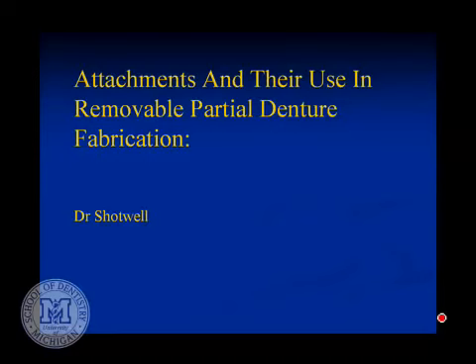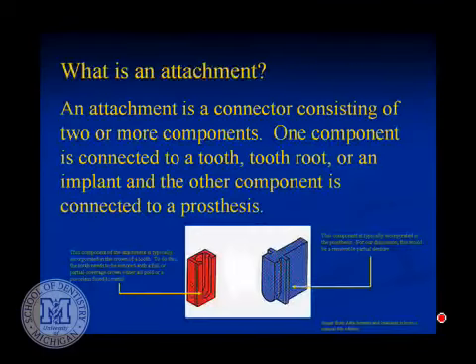So what do we want to talk about today? Just attachments, different kinds of attachments. Many times we used to call them precision attachments, connoting some sort of extremely precise fit of the different components of the attachments.